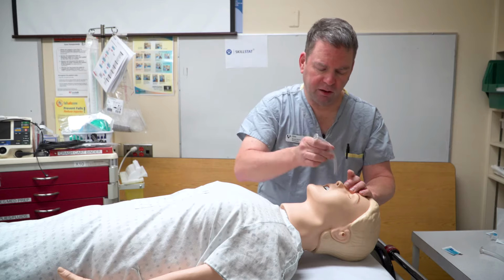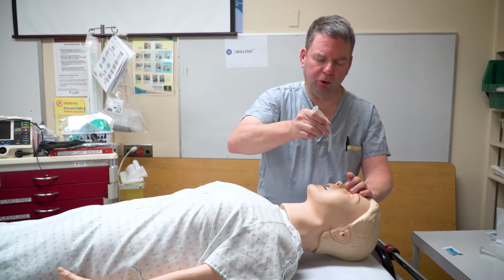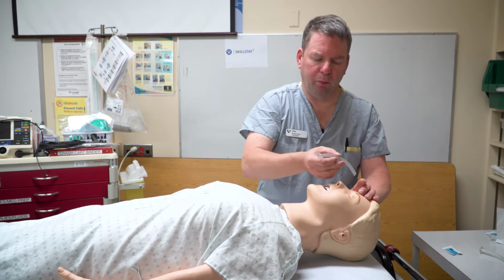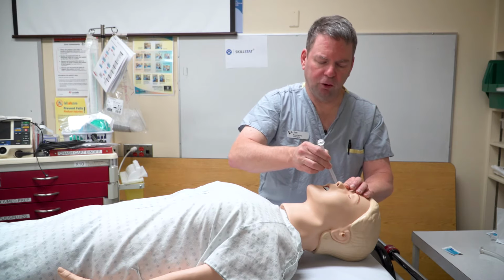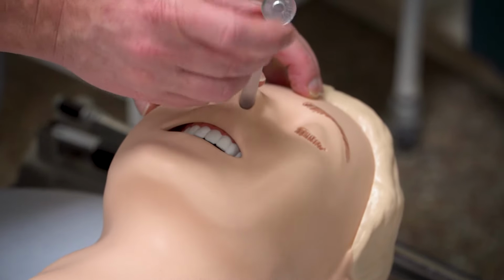And when you're going into the nose, realize that the bottom of the nasal passage is the widest part, so you want to actually go straight in following the roof of the mouth. A lot of people tend to go up. The further up you go, the tighter it gets, so it's actually tolerated better if you go straight down. So I'm going to put this into one side, going straight down following the roof of the mouth.